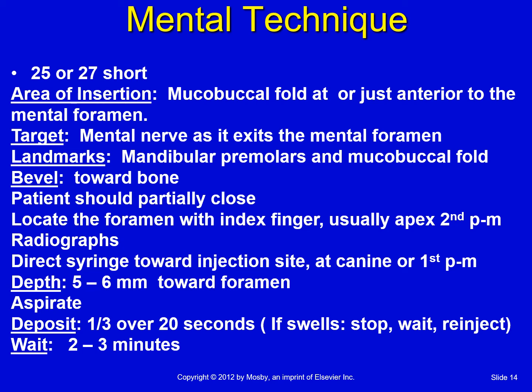You aspirate twice, and if that's negative, you can deposit one third of a cartridge over 20 seconds. If it starts to balloon up and swell, you want to stop, take your needle out, wait until all of that can diffuse a little bit, and then you may need to re-inject. And on this one, you just need to wait about 2 to 3 minutes.